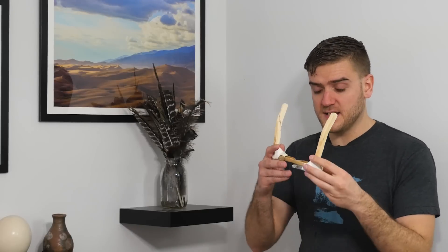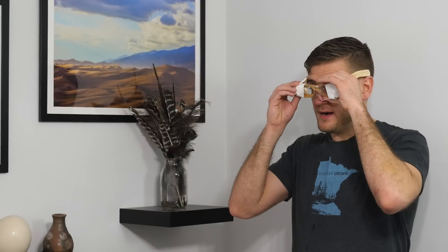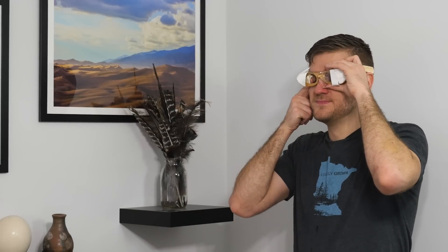So to answer the question: can you make lenses out of ice? The answer is yes. But should you? Probably not. They are incredibly impractical. But it is possible. And there goes the other lens.